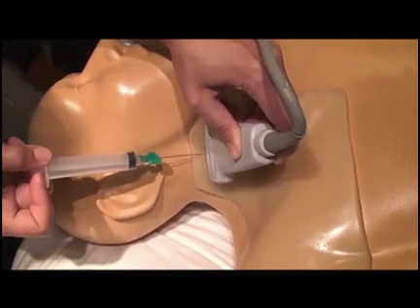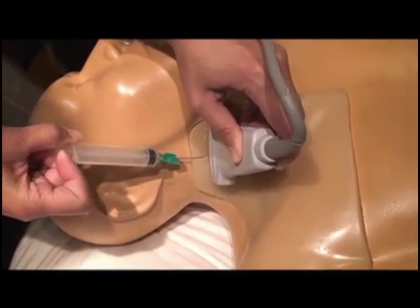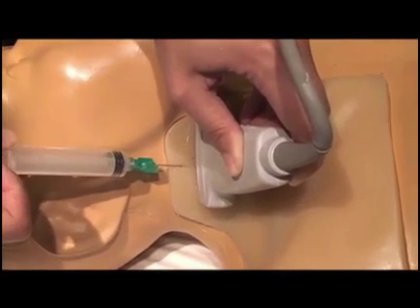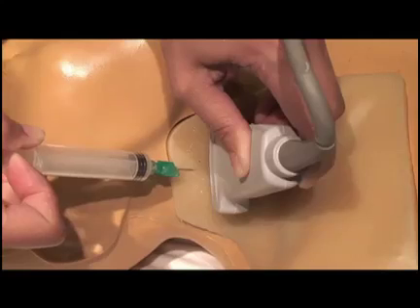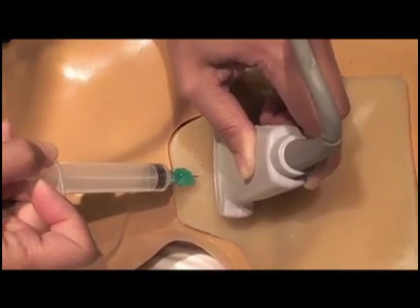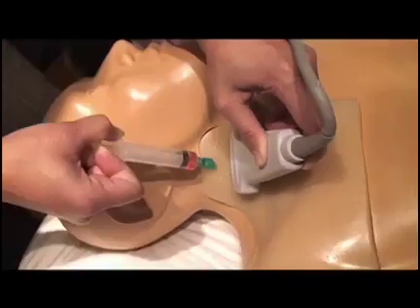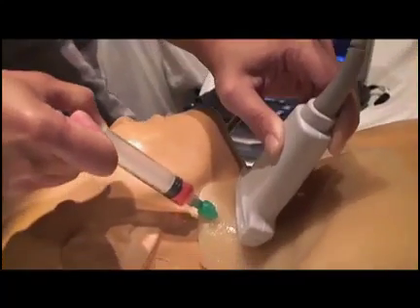Here we use a simulation model to show the correct approach for a short axis cannulation of the internal jugular vein. Notice the probe is in a side-to-side or short axis orientation and the needle is coming in at a 45 degree angle underneath the probe. Remember that we must move the probe distally to stay in plane with the needle tip as we advance it underneath the skin and into the internal jugular vein. As we do that, we notice that we've successfully cannulated the internal jugular vein as shown by the red flow of blood.